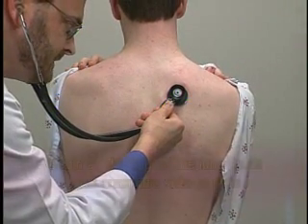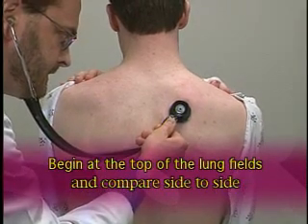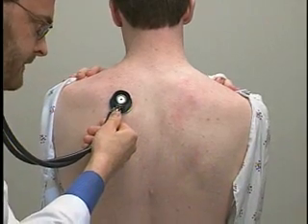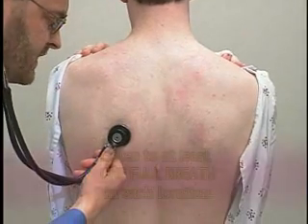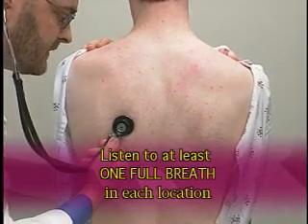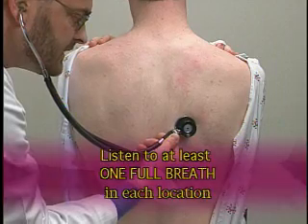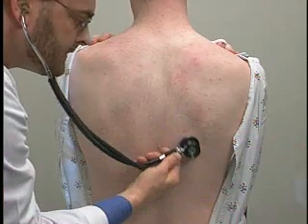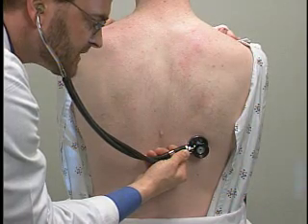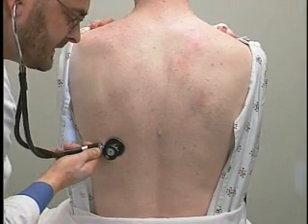Ask the patient to take some slow breaths. It's very important to keep your stethoscope on the chest wall during the entire respiratory cycle. The patient needs to complete an entire inspiratory and expiration cycle. When expiration is complete, move your stethoscope quickly to the opposite side.